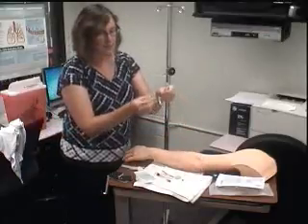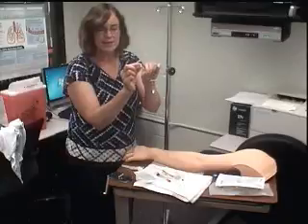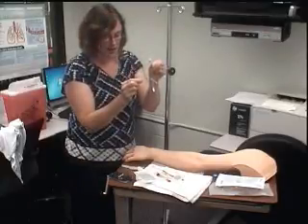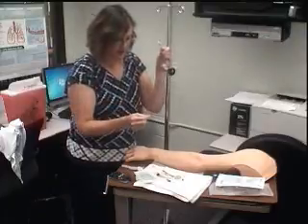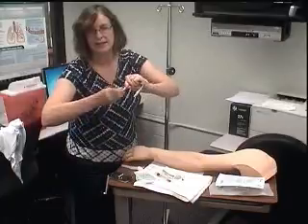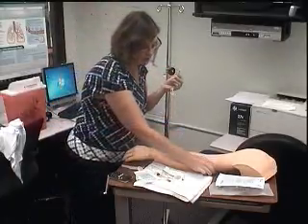So this would come out of a package brand new. As long as I haven't touched this, it's still sterile. I don't necessarily have to clean this hub, but if I touched it by accident, I could clean it with a hub scrub. You put it on there and you clean it, clean it, clean it. If your facility doesn't have that, you would just use an alcohol swab very well.